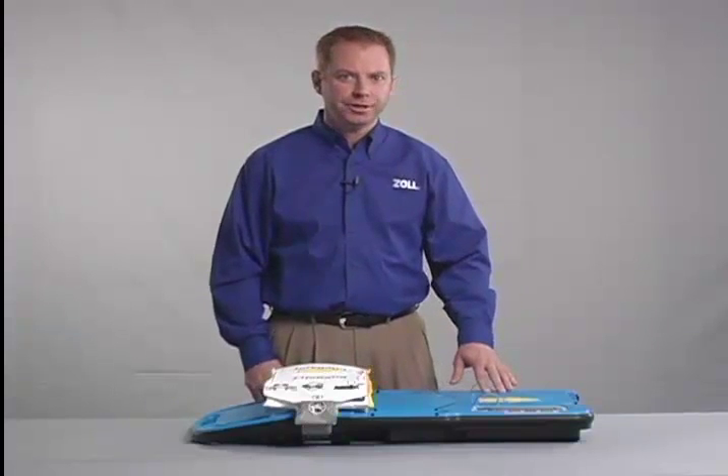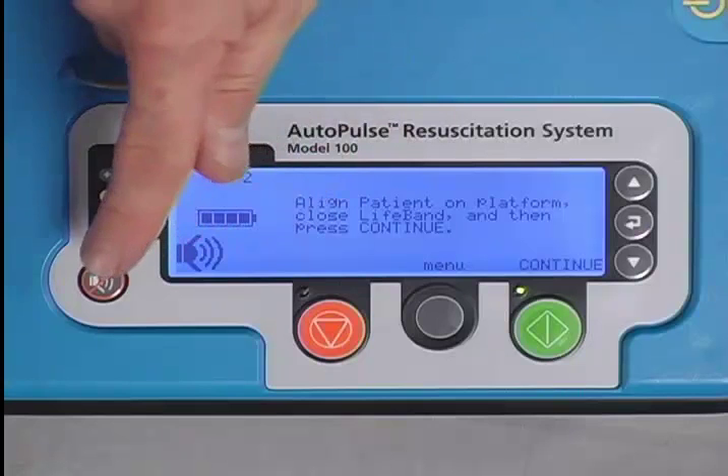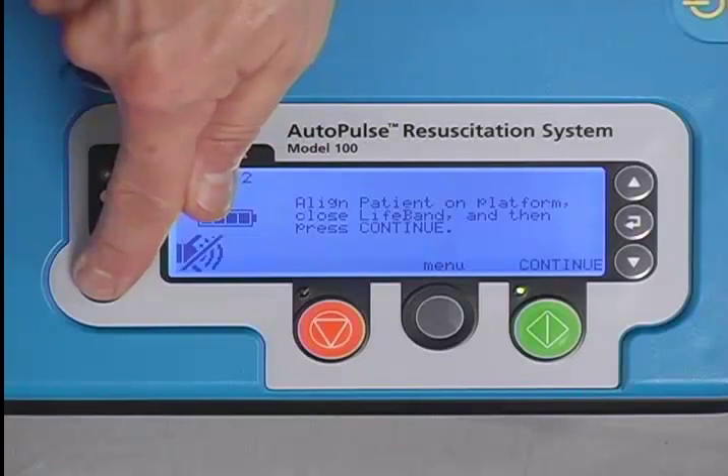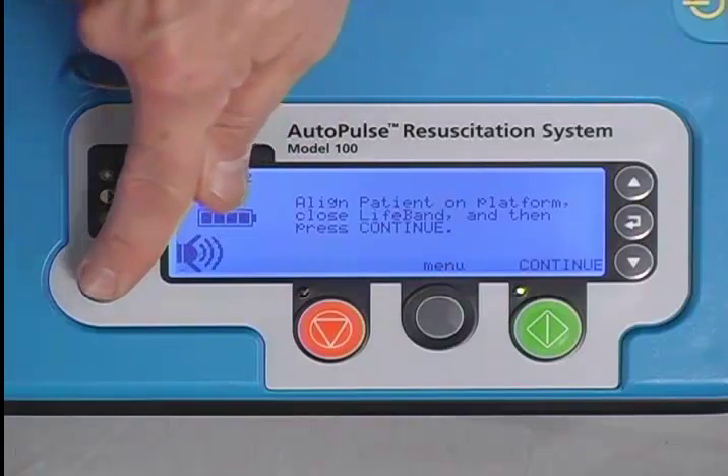Low battery, ventilation, and pause alert tones cannot be turned off, but they can be muted for 30 seconds using the mute button. Pressing the mute button again re-enables all tones.